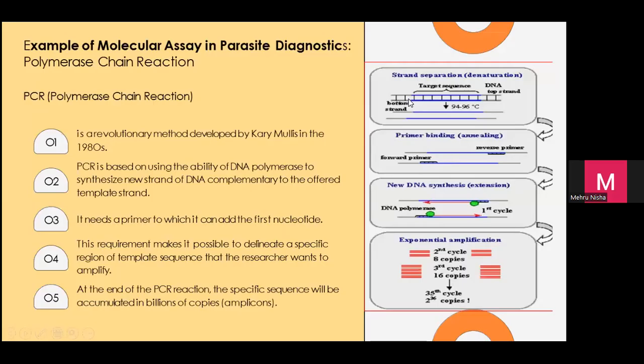Okay, so this is example of molecular assay. Okay, so we will see overall, then kita akan pergi ke different molecular assay yang kita tahulah, yang commonly used.